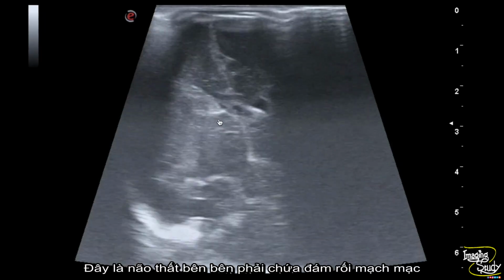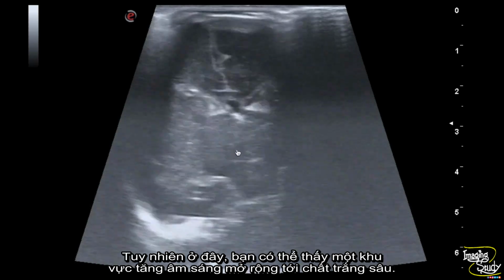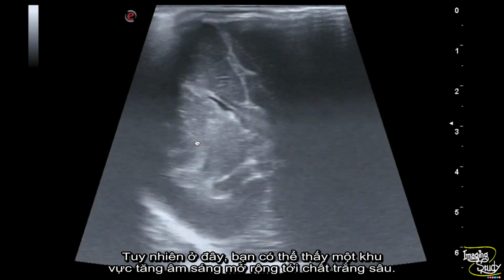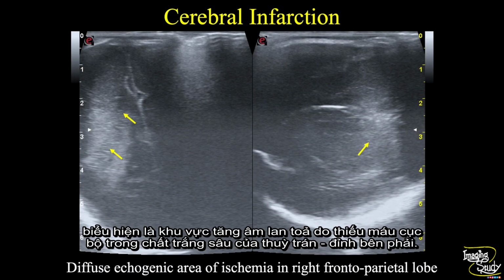This is the right lateral ventricle containing the choroid plexus. And lateral to it, if you check here, the periventricular echogenicity is increased. But here you can see a bright echogenic focal area extending to the deep white matter. So this is nothing but the cerebral infarction, where we have found a diffuse echogenic area of ischemia in the deep white matter of the right frontoparietal lobe.